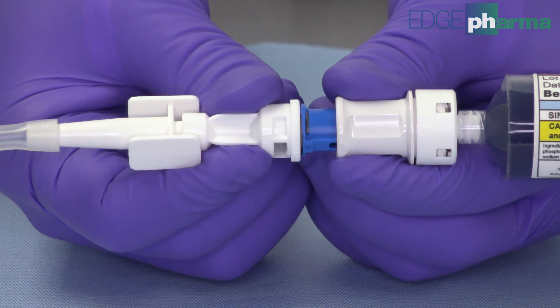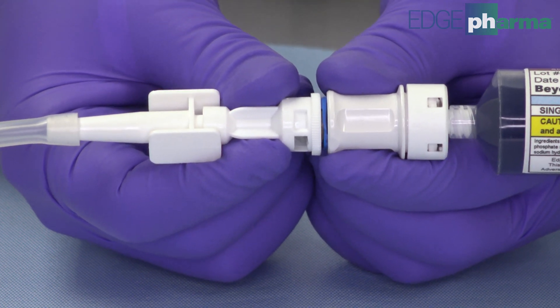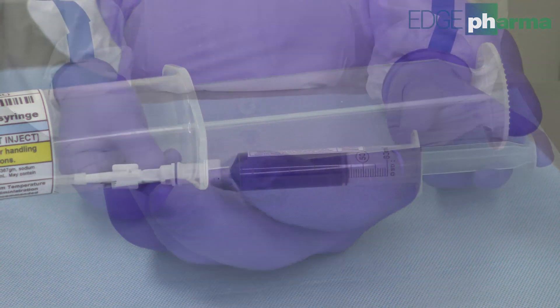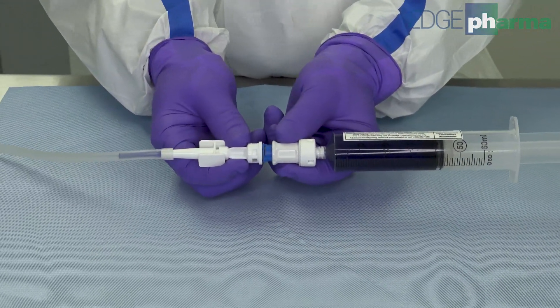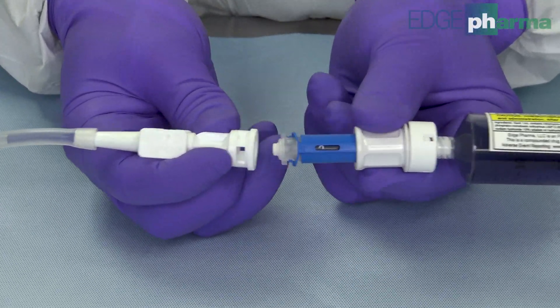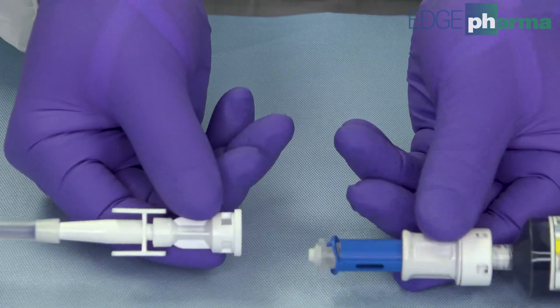Engage the closed system transfer device. You are now ready to administer the dose. After administration, the closed system transfer device can be disengaged and then disconnected from the luer lock adapter for disposal in a hazardous waste container.